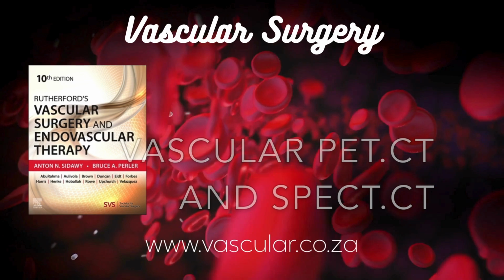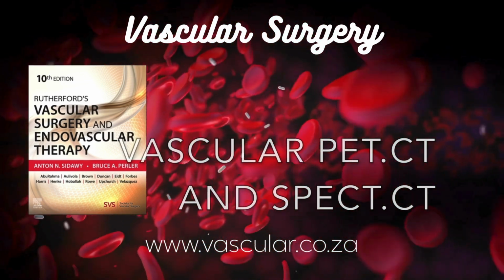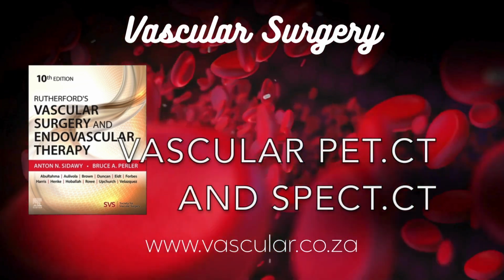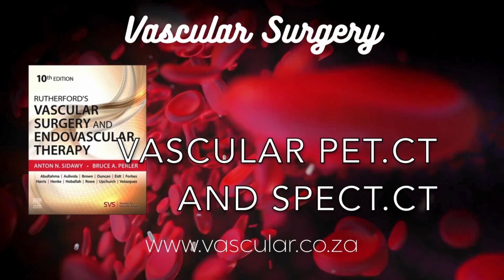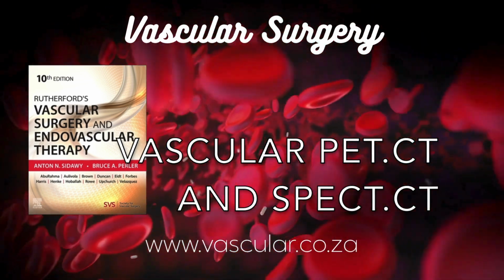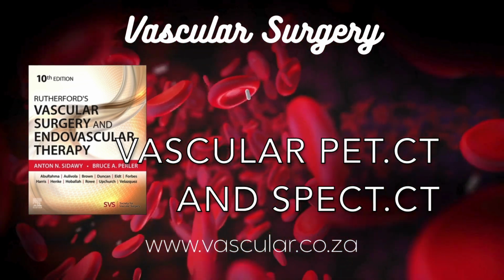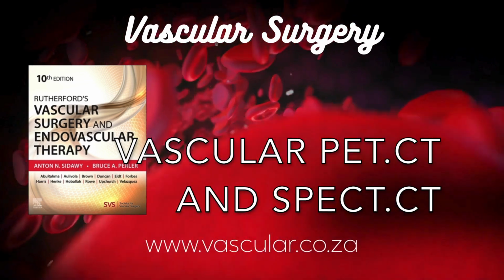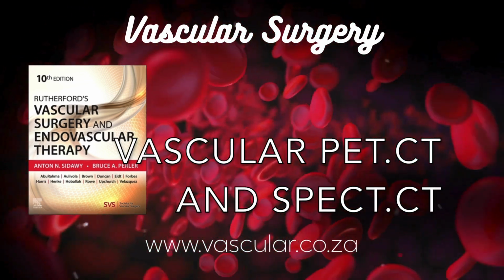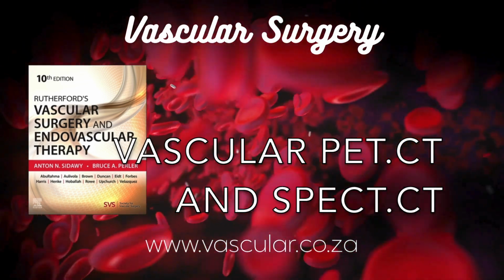Okay, PET sounds like it has some advantages. Better picture, quantification. Now the CT part, why add that? Good question. Because both SPECT and PET, fundamentally, they show you the function, the metabolic hotspots. The what's happening. Exactly. But they don't give you a super detailed anatomical map on their own. You see a blob of activity, but is it in the vessel wall, next to it, in a lymph node? Right, the where is missing. That's where the CT, computed tomography, comes in.